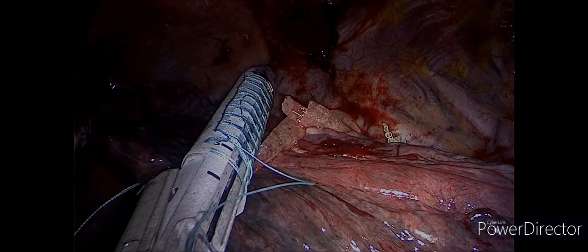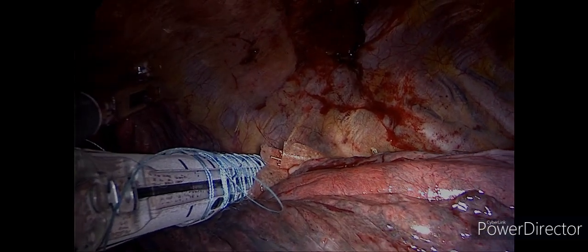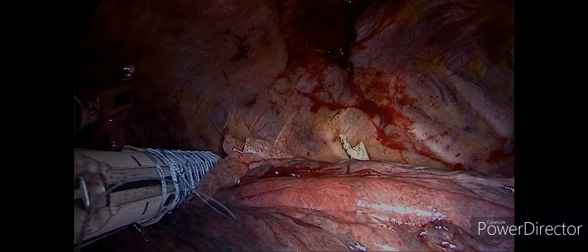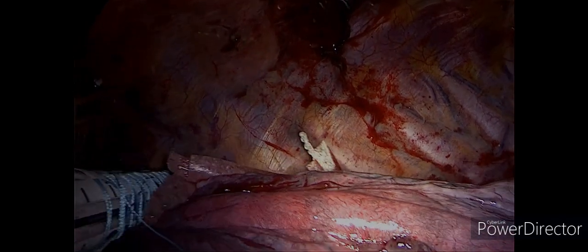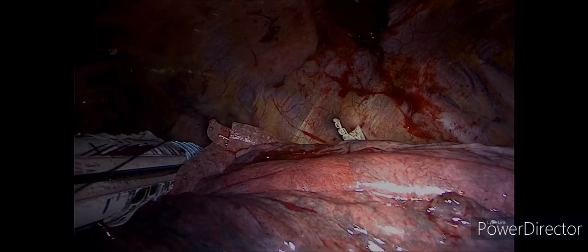We found some small bullae here and there that we elected to resect as well. We wanted to remove as much as possible to make sure, first of all, that we don't have any air leak from these small blebs mimicking an air leak, and second of all, to try to improve the expansion of the whole lung.